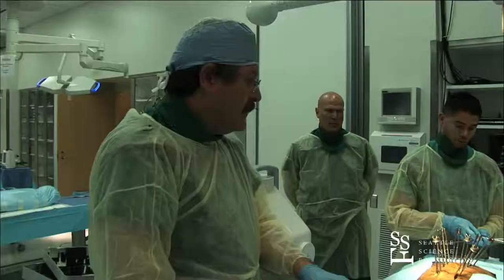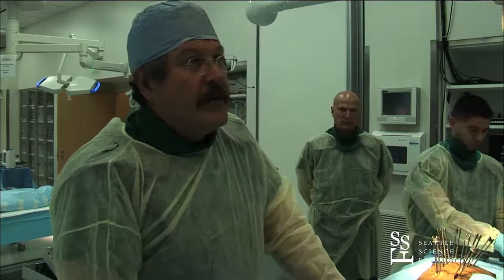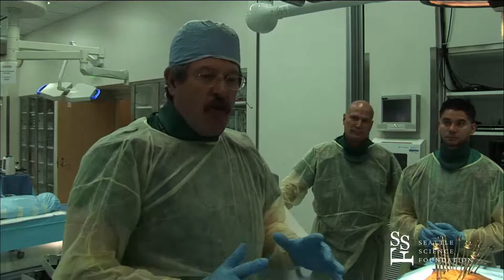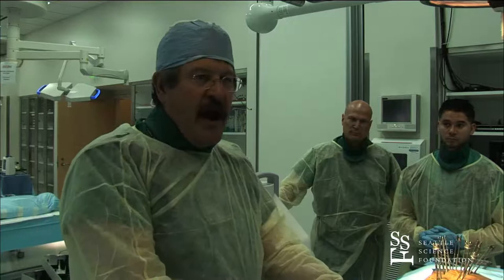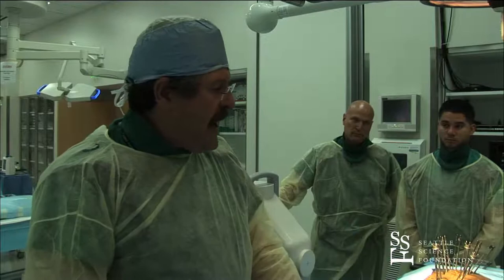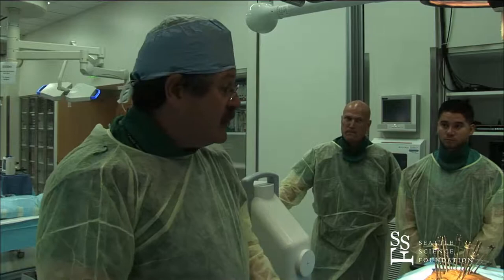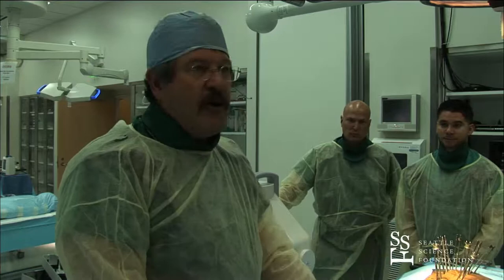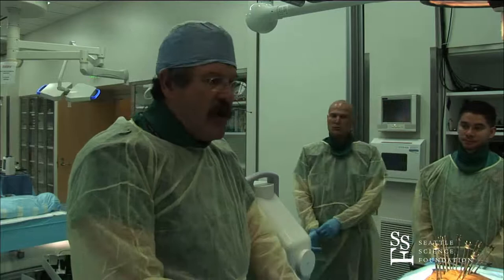This has been a very impressive demonstration of converting to selective MIS surgery. Make no mistake — I'm still very leery of it, but I think it has a role. We need to identify what the good things about MIS are and apply them to the right patient. What bothers me is when someone says 'I'm an MIS surgeon' and applies it to everything. The pathology isn't always amenable to that, and there are people doing a bad job with it. In trauma specifically, ankylosing spondylitis fractures are ideal for MIS — you just have to be careful with your rod contour.